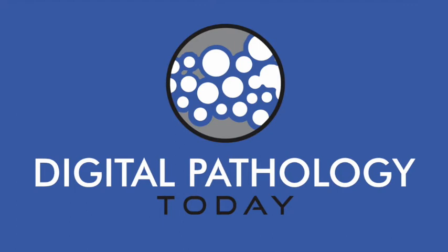The second question, and that's where we, with the working group, are investing a lot of energy, is what is important in terms of outcome. So it's true when somebody tells me a digital pathology tool is much more accurate than the pathologist, which is true, because what we do as pathologists, as we do for every biomarker, we estimate. We estimate intensities, we estimate proportions, we estimate whether this is a mitotic figure or whether it is not a mitotic figure. For this is exactly the same.